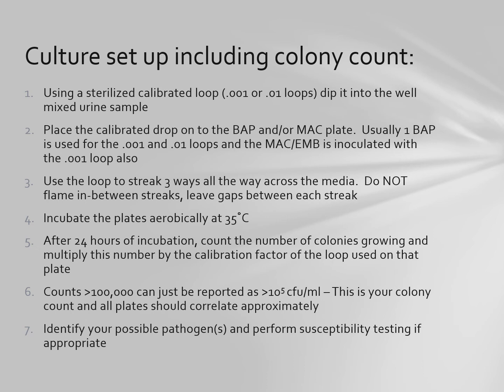Okay. Now anything over 100,000 is considered significant, so we don't keep counting above 100,000. We simply say it's greater than 100,000 colony forming units per mil, and then we know it's significant. After we have our colony count, then we want to identify our possible pathogen and perform susceptibility testing if it's appropriate to do so.